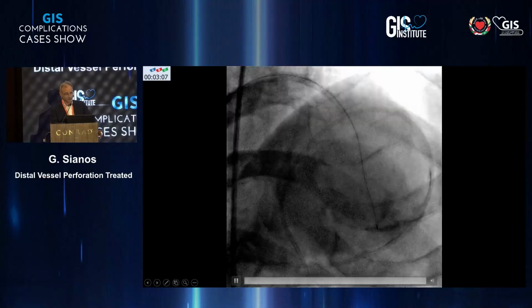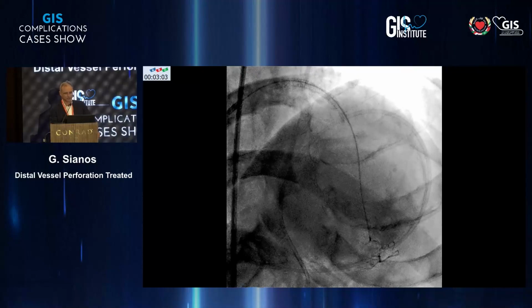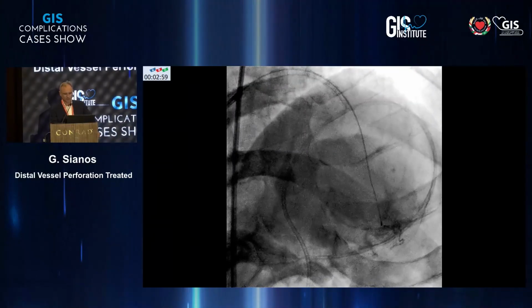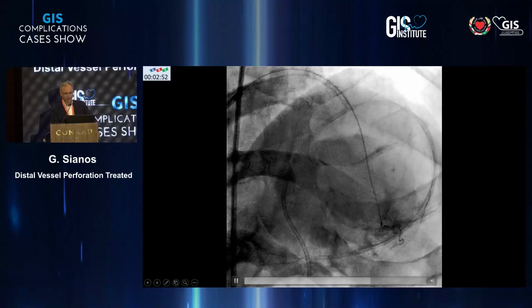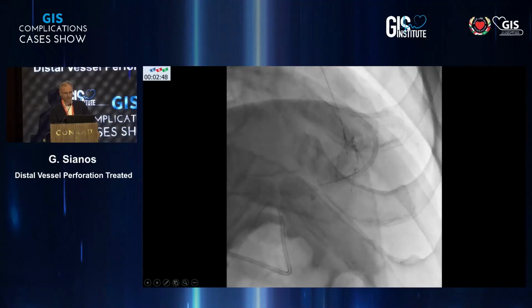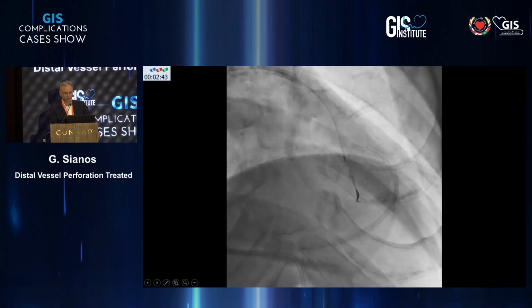It's not always the very best to tip inject there because you might have a perforation that you make bigger. But here it was unclear that it was leaking, and finally it's obvious that it was leaking from this collateral, as I told you, the apical collateral from distal PDA to distal PLA, because the 2 other collaterals were going into this direction. You can clearly see it. We made it bigger by the tip injection when you pressurize it.